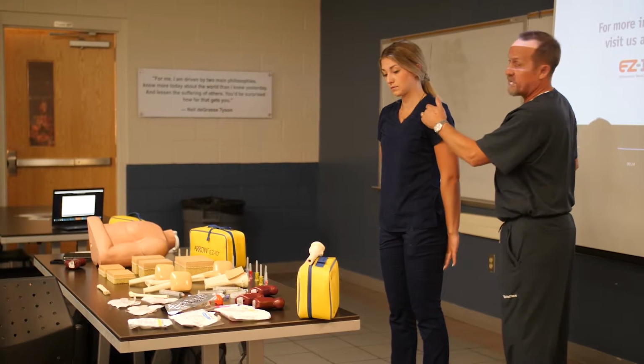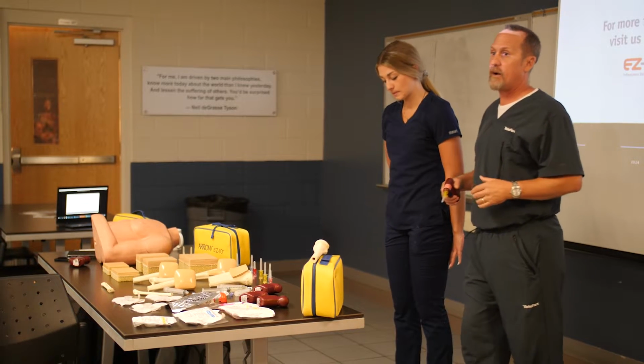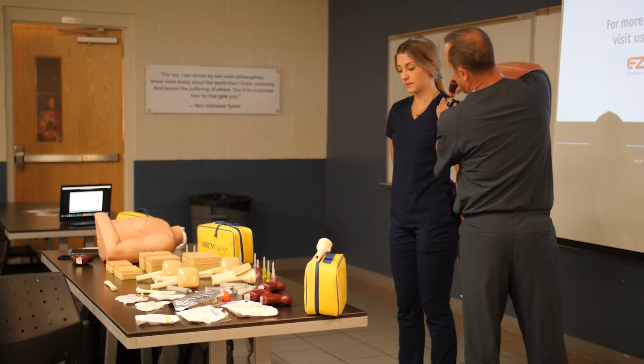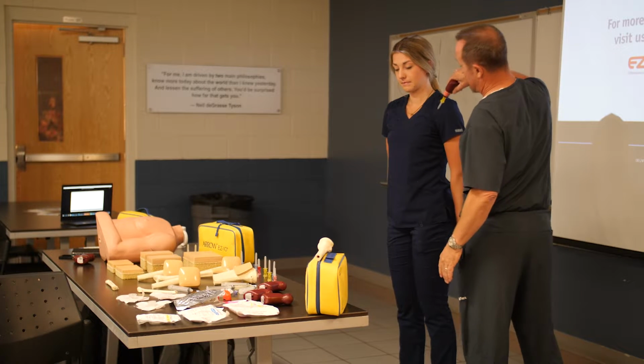And we're also gonna go from anterior to posterior. So what we're doing is we're aiming for the opposite hip pocket. Does that make sense to everybody? So when I go into her, I'm gonna go at about this angle right here. Okay? And we'll drill straight in.